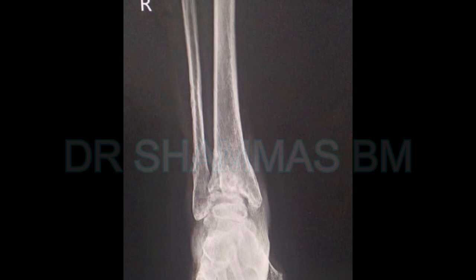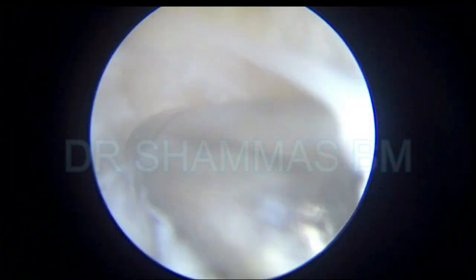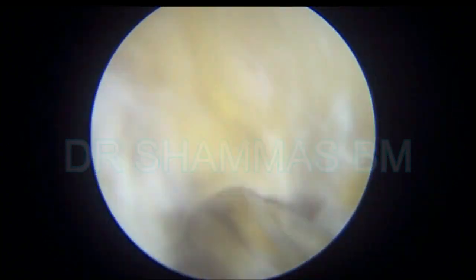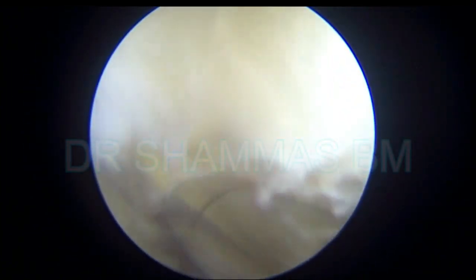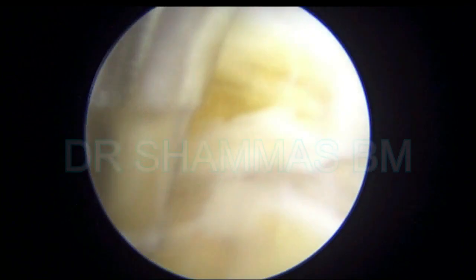This is the AP view of the ankle and this is the lateral view. You can see that the joint is almost lost. Coming to the arthroscopic view, the whole joint is severely fibrosed. You cannot see the joint line, and I am keeping the instrument close to the bone and clearing the area. All the fibrosis is removed slowly.